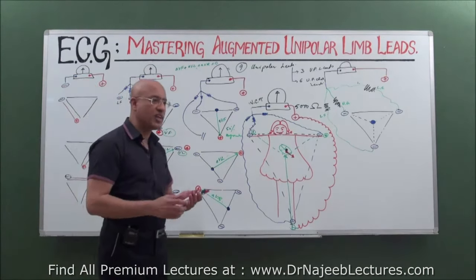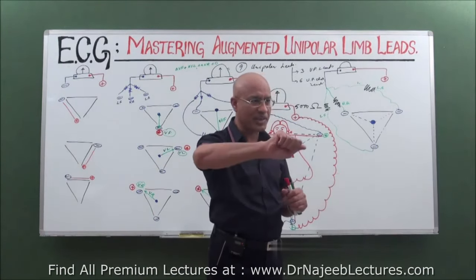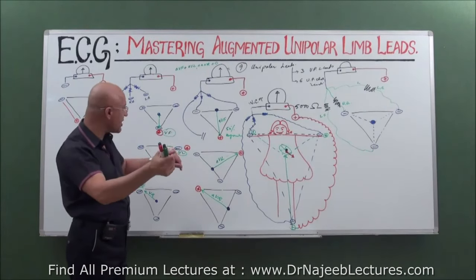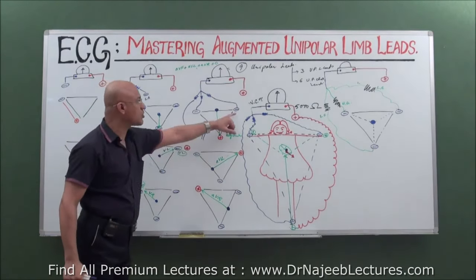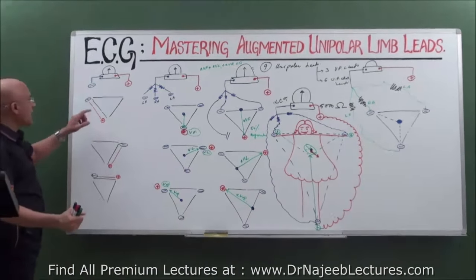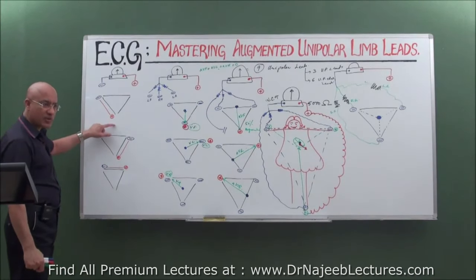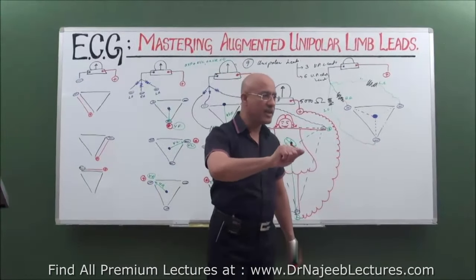Remember, we don't need to do this ourselves. These days, ECG machines are very smart. We just put the selector where we want to record, AVF. Automatically the machine's internal mechanism will make this electrode positive and these two negative. If you put the selector on lead number two, only two electrodes will be left active: right arm negative and left leg positive. So we have to understand them, but actually the machine does it automatically.